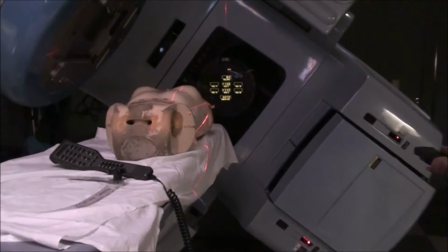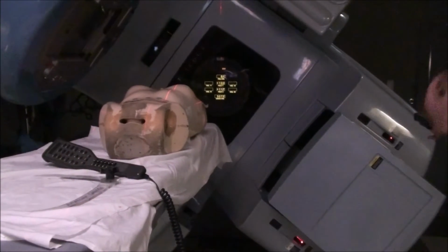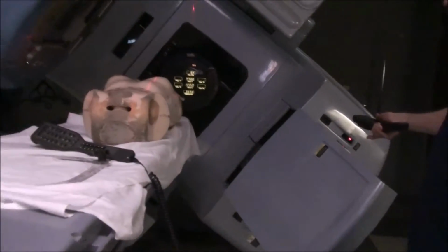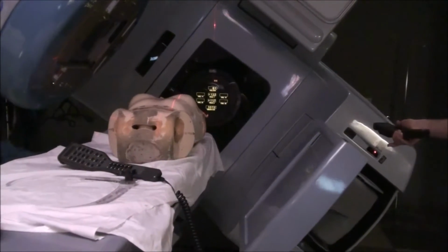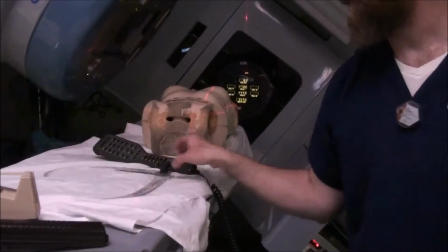I apologize. Give me a second. It's important to have the image intensifier out so that I can demonstrate some of the pitfalls that are going to come your way when you simulate a real breast on a real simulator.